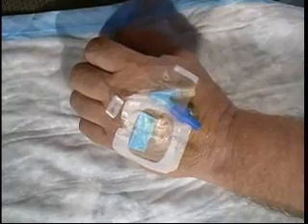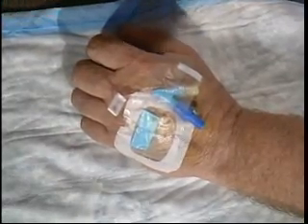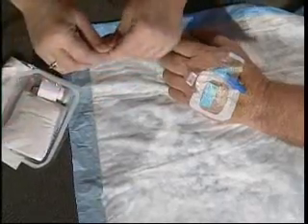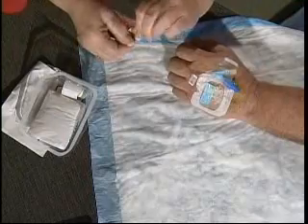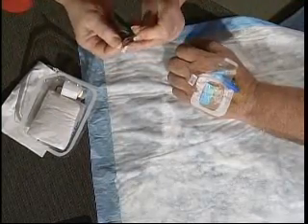When it's time to remove such a device, you may use a start kit if you wish. You can certainly use gauze pads if you prefer. But again, standard precautions apply because potentially there is exposure to blood and there could be the issue of bloodborne pathogens. Again, I'm going to rinse my hands before I don my gloves. I'm not going to use all my components in the tray because, again, I'm not going to insert a catheter. But I am going to wash my hands with this alcohol-based gel.